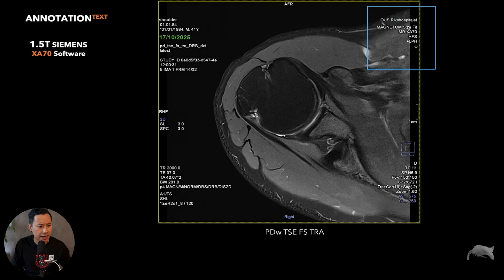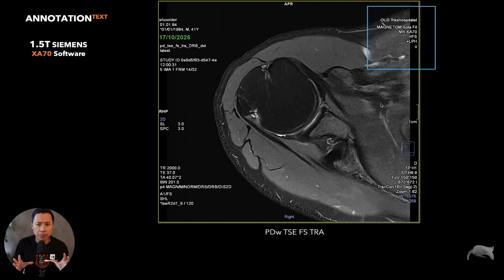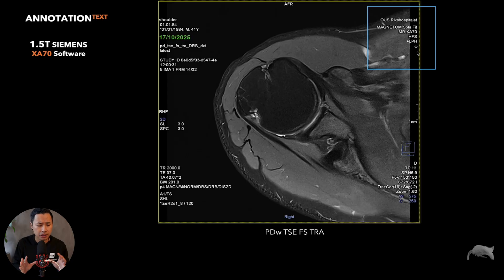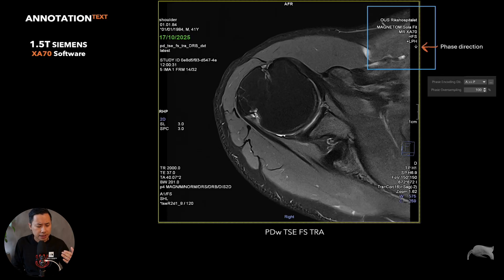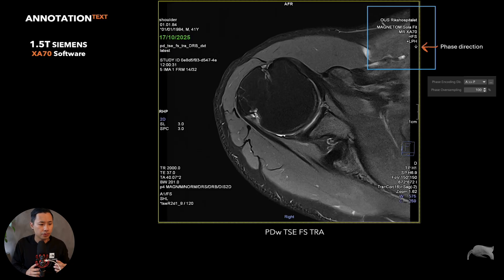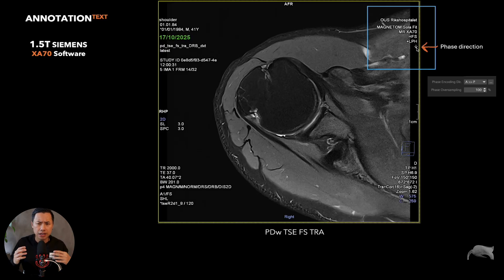In the upper corner it shows the patient location and scanner software information - for example 'head first supine'. If you do feet first supine it will also show that. Another important parameter is the arrow, which tells you about the phase direction. In this shoulder example the phase direction was AP - anterior to posterior. If you're doing right-left, the arrow will go the other way. It just gives you a clue about what phase direction you're using.